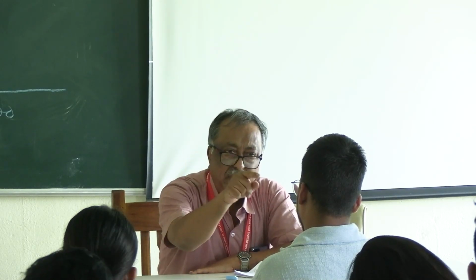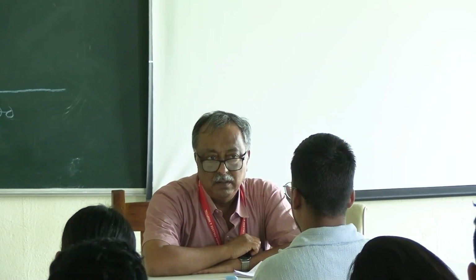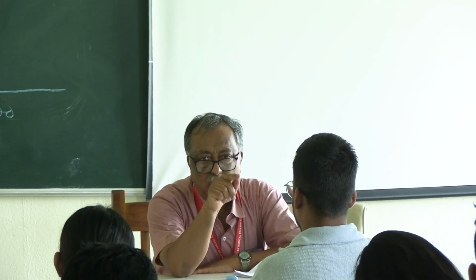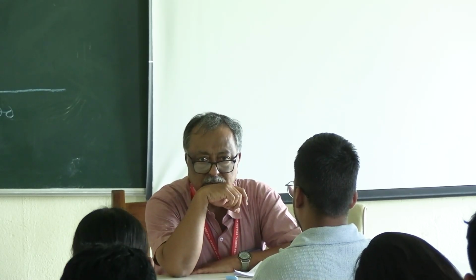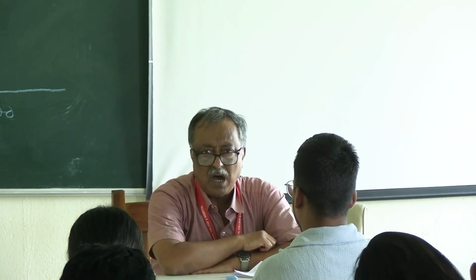Suppose I am doing the stapedial reflex for him. He has a 20 decibel conductive hearing loss at 500 hertz.